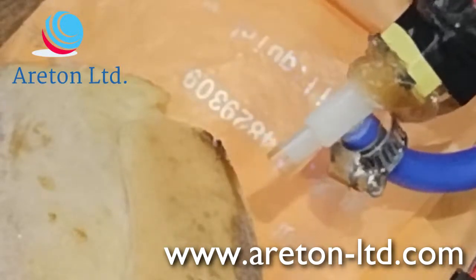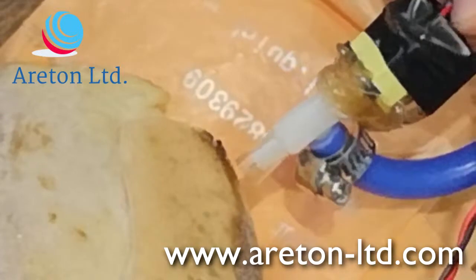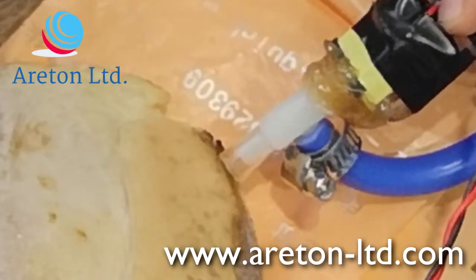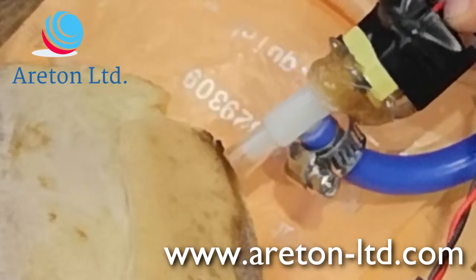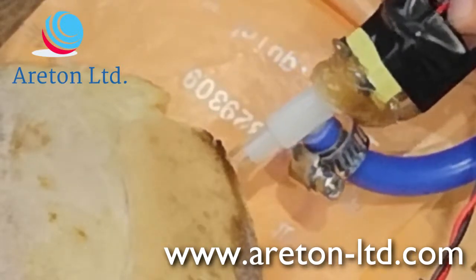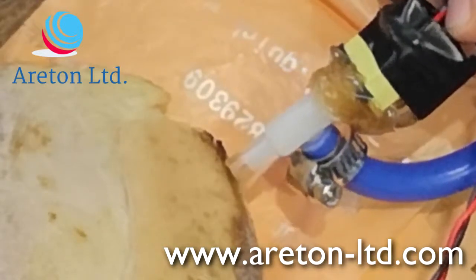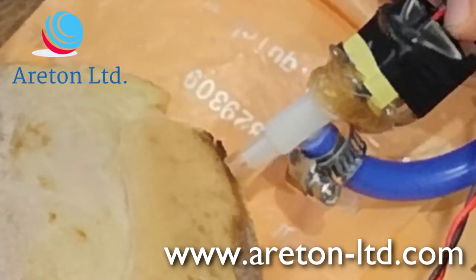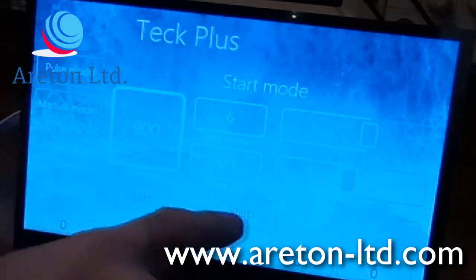Look. And it's off. What has happened there is that it had been on for a while longer, simply because it hadn't detected the arc being on, because of the setting of the device. That's something that we're going to sort out later on, but that gives you the idea.